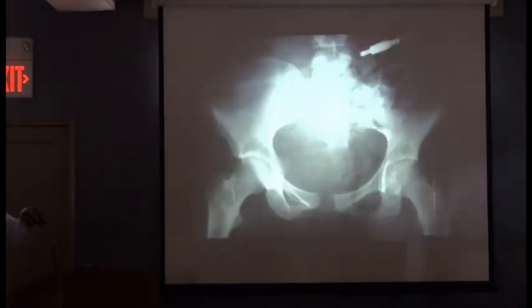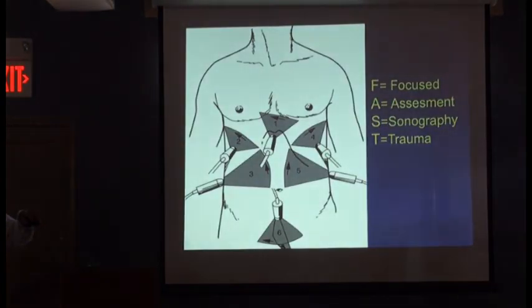All right, that's pelvis. I'm going to skip that. I'm just going to quickly show you. Here's our FAST. Did you guys know what a FAST is? I know you do, but it stands for Focused Assessment Sonography for Trauma. Can someone tell me what we're looking for in a FAST? I know you guys know this, but that's it, right? That's exactly right. And everyone said the same thing, fluid. That's all we're looking for in a FAST.